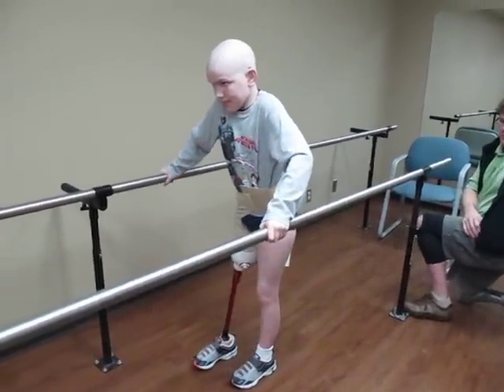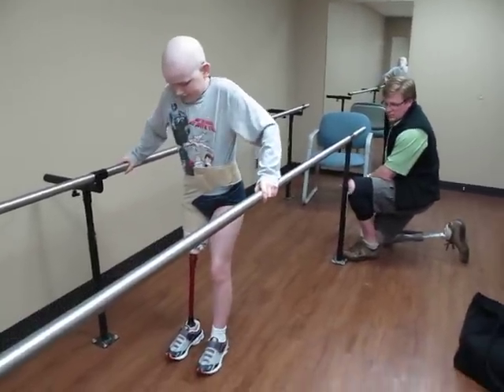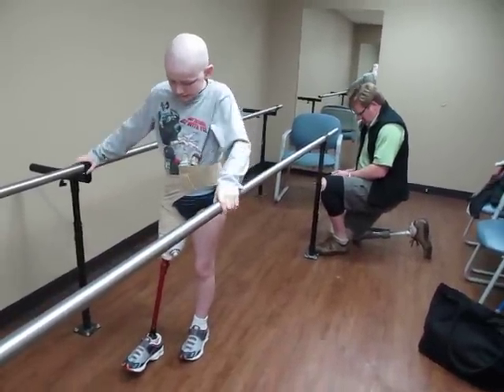Hey, that — Truman, that foot looks much better, that shoe looks much better, doesn't it? Having a shoe down there, doesn't it? Yeah, it does. It looks really good.